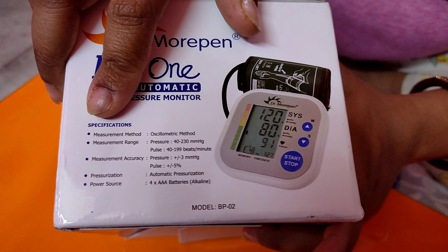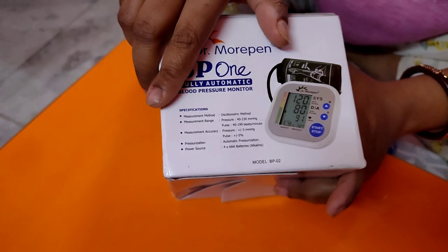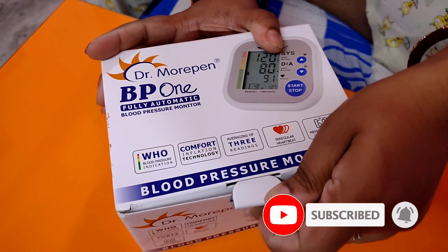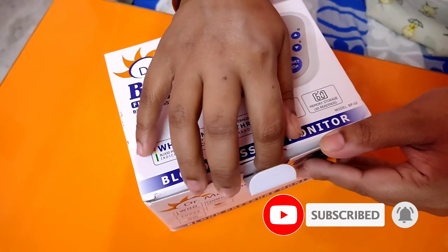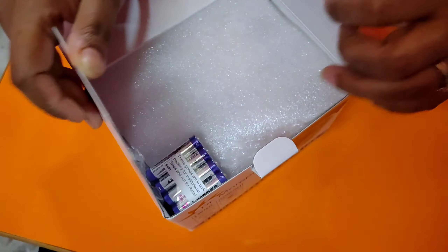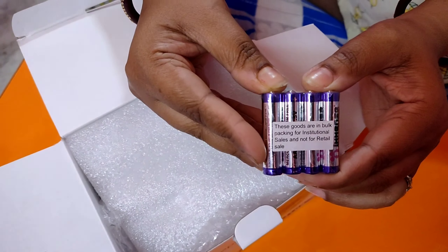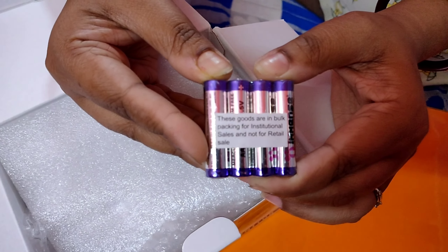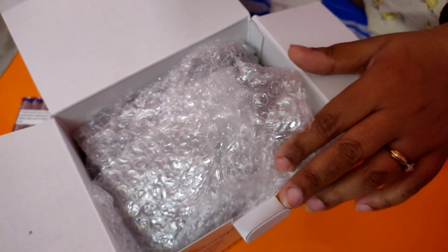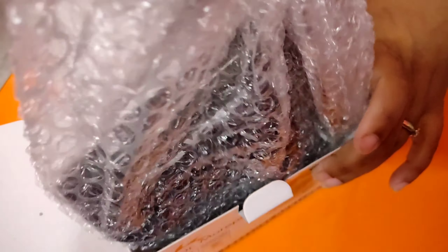The measurement method, the measurement range, the measurement accuracy, pressurization, and the power source have been indicated on the box. Opening the box, I found 4 AAA size batteries which are the power source of this machine. Inside a bubble wrap, there is a cuff, a blood pressure monitor, and a user manual.